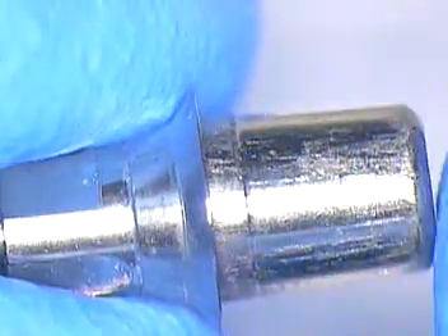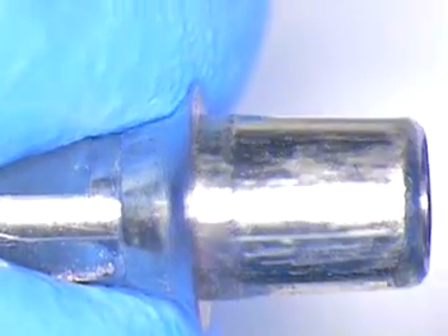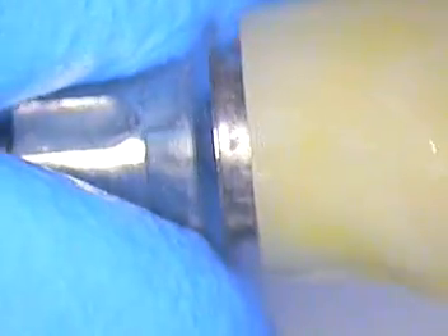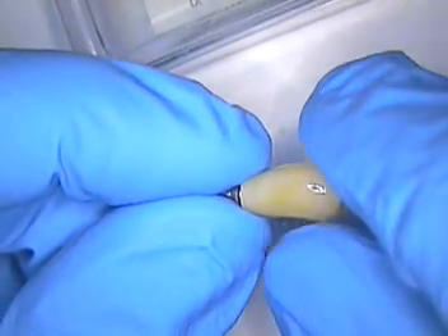So this is the component — we'll look at the side of it. Now I'll bring up the crown so we can look at both together. There it goes — clicks into place like that. They cement these two components together with Panavia. I suppose you can use any good resin cement, but they like to use Panavia. Then when that's set, it's actually placed on the model. Sometimes I'll have them cement this when it's attached to the model first.